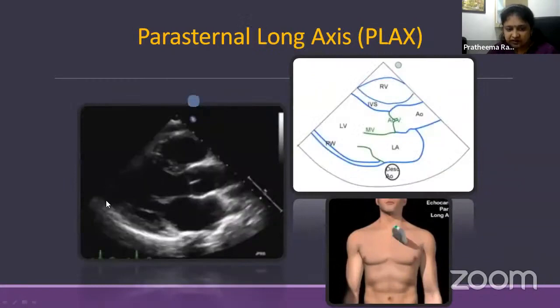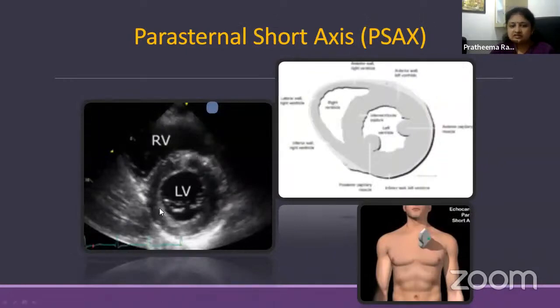So this gives us the ejection fraction. We can see how much the LVOT is, and we can measure the velocity time integral. These are all fancy terms, but it is basically to calculate the cardiac output. So we all know that the left ventricle will contract to eject blood through this. If we measure the velocity, how much the aortic valve is opening and how much blood is ejected through the aorta, we can find out the cardiac output. It is literally in proper English, only that we are measuring in this view. And we can see the contractility.